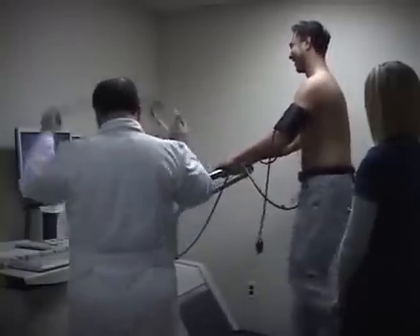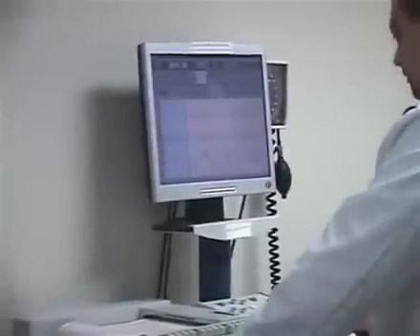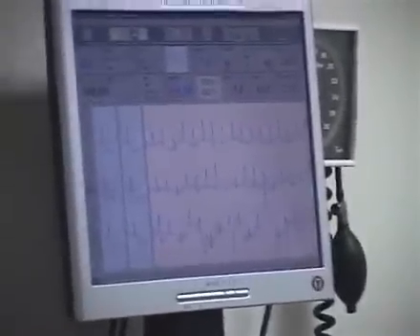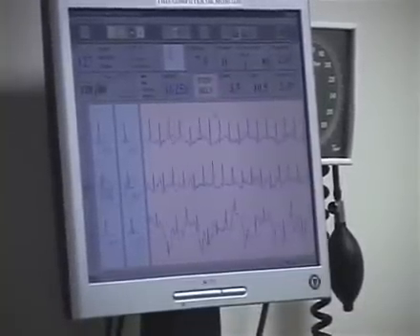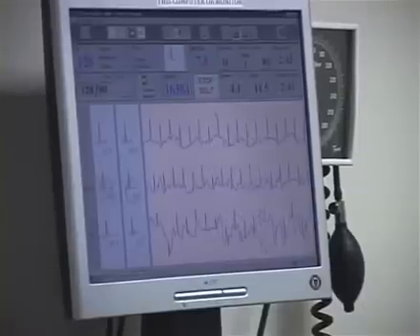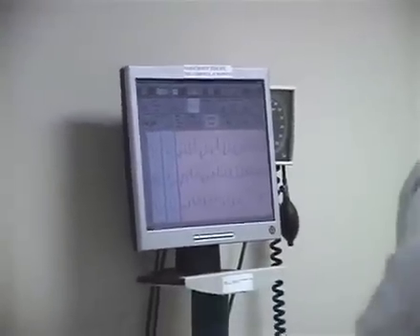As he gets comfortable during the treadmill stress test, once the first stage is finished, the second stage goes faster and higher. We continue this process every three minutes until we reach the target heart rate. The target heart rate is a specific number for every person according to age — the formula is 220 minus the age, and we usually try to reach 85% of that number.